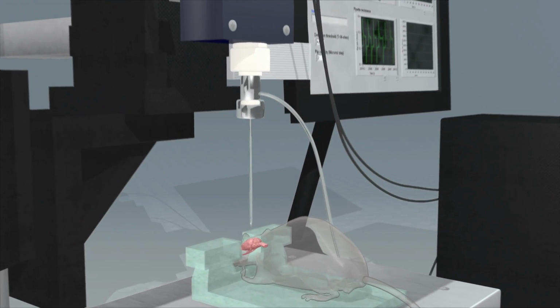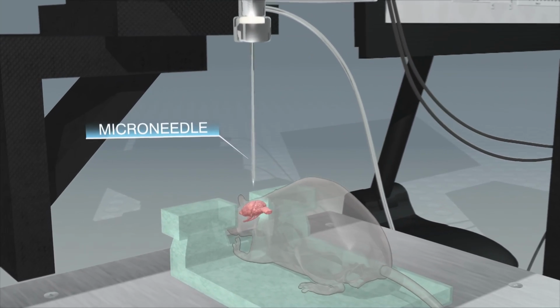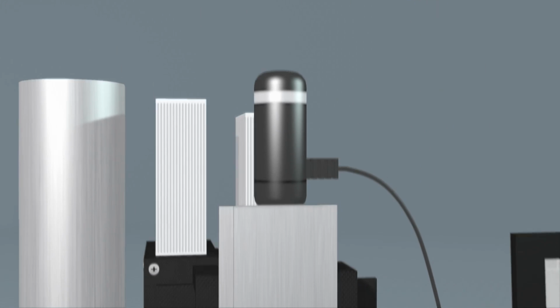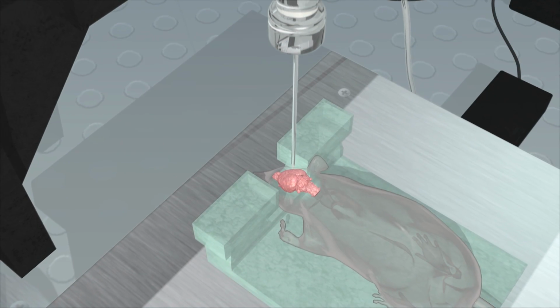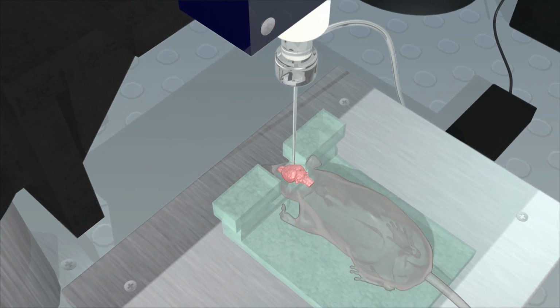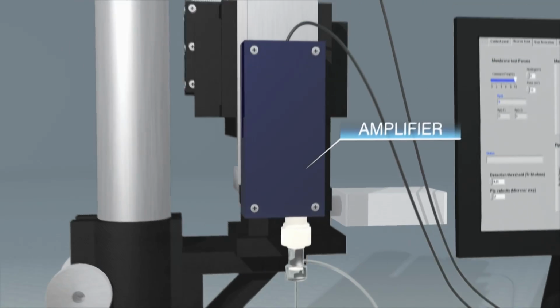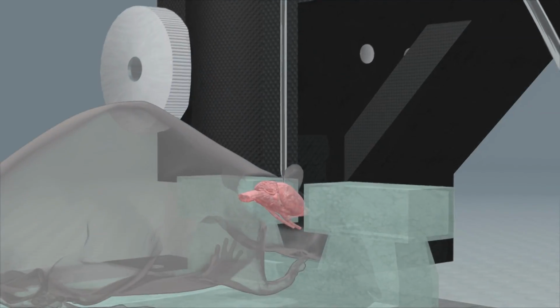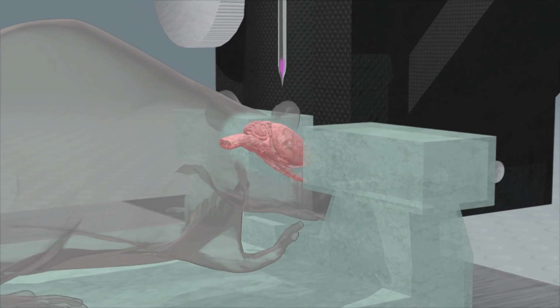The robot consists of a glass microneedle, known as a pipette, with a tip just a micron wide and filled with electrically conductive fluid. The pipette tip can be moved around by a precision motor. The robot docks the pipette to a single cell in the living brain, so that the pipette can capture electrical signals and molecules from the cell. The electrical signals are transmitted up the pipette, amplified, and sent to a computer. The molecules can be harvested by extracting the contents of the pipette.